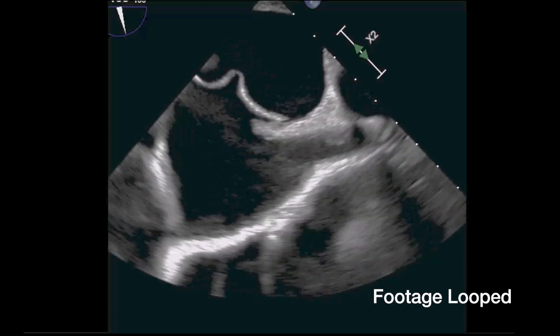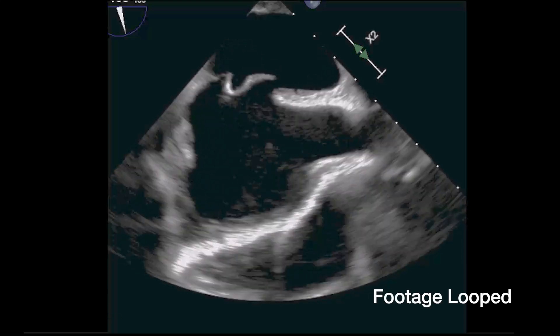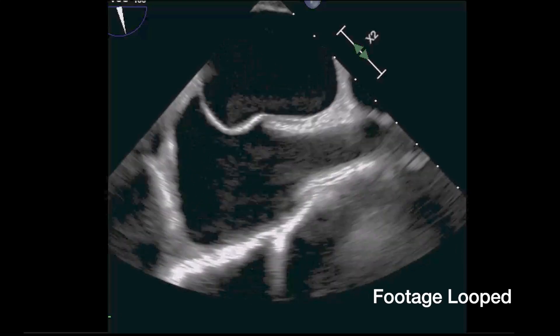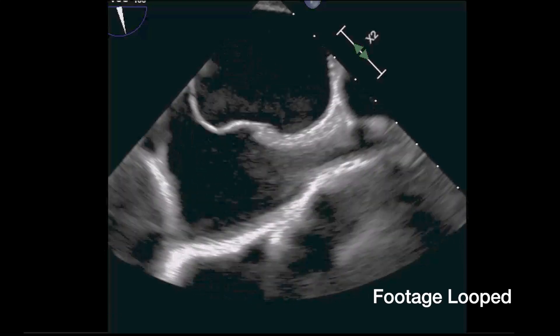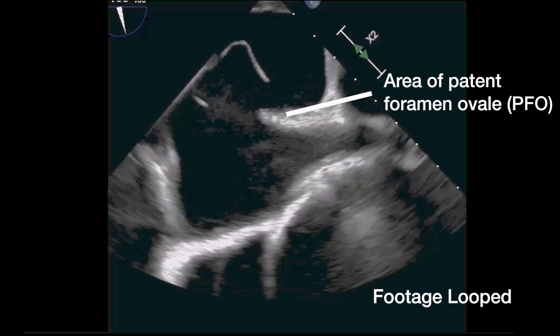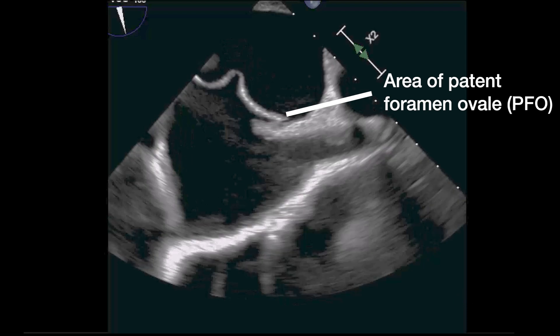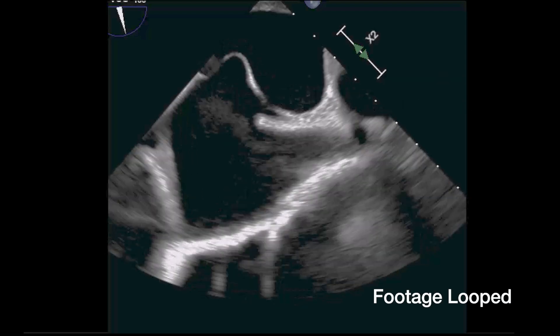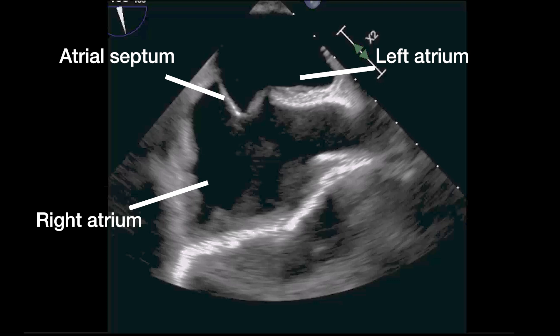Here, we show a transesophageal echocardiogram with agitated saline detecting a patent foramen ovale, or PFO, which is an opening caused by incomplete fusion of the atrial septum. Labels show the right atrium, the left atrium, and the atrial septum that separates the two chambers.